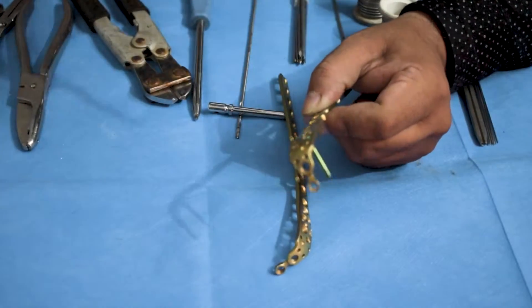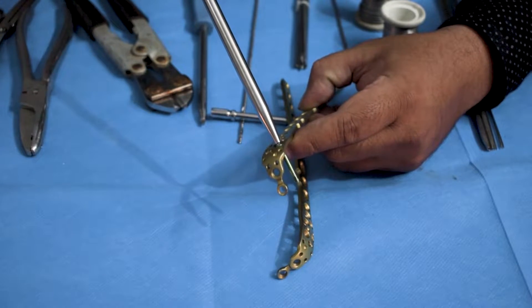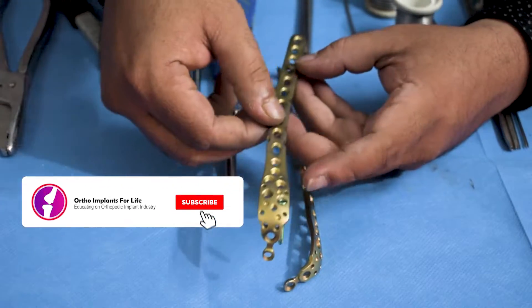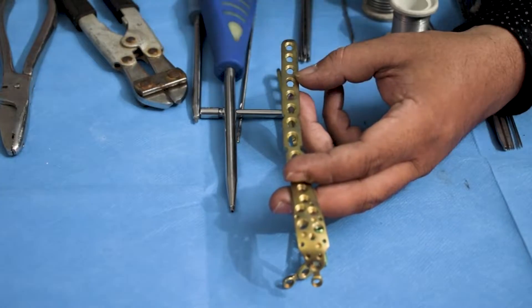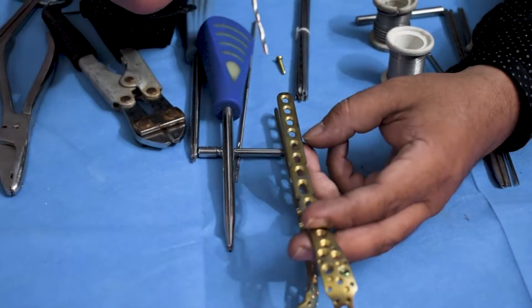Always remember: the locking screw holds both the bone and the plate together. After fixation of the locking screw, in order to fix this plate in the shaft portion of the olecranon, one can use both locking or non-locking screws as per the surgeon's instruction.